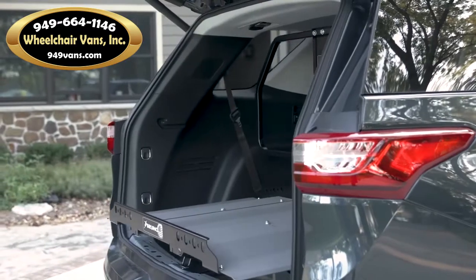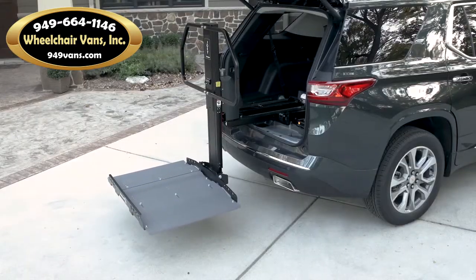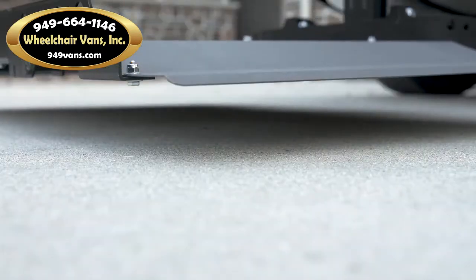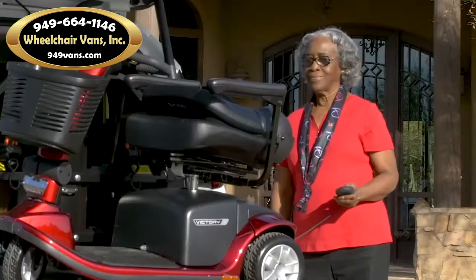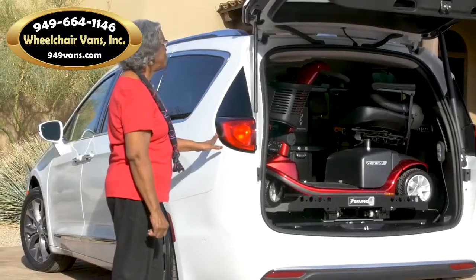The compact Joey allows second-row seating to be retained in most vehicles so you can take both your mobility device and passengers to your destination. Your local factory-trained Bruno dealer can quickly install a Joey, and if you purchase a different applicable vehicle in the future, it's likely the Joey can be reinstalled.